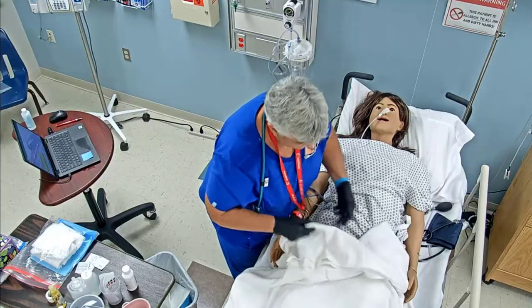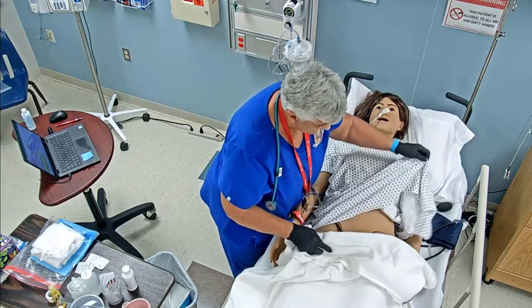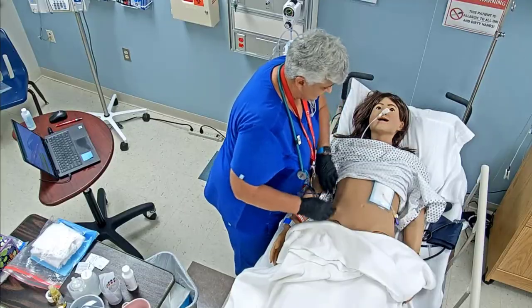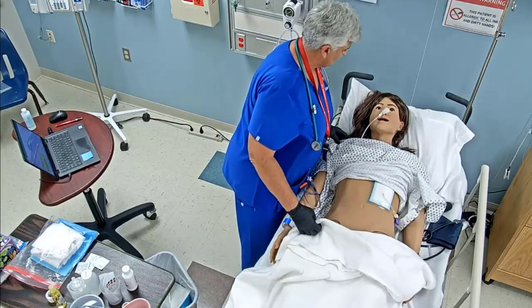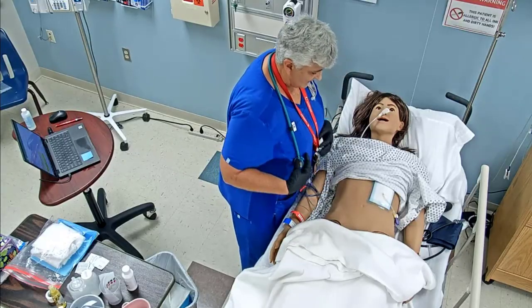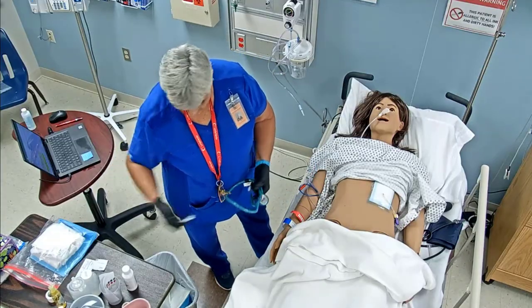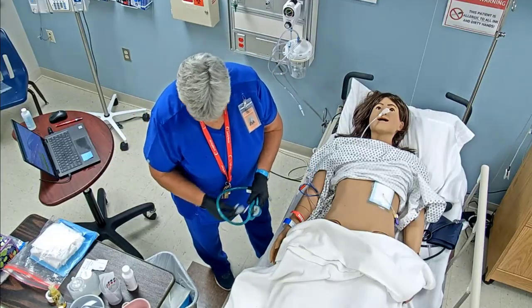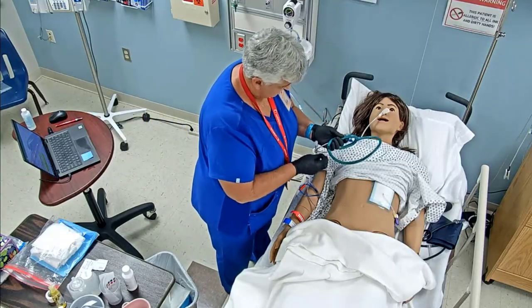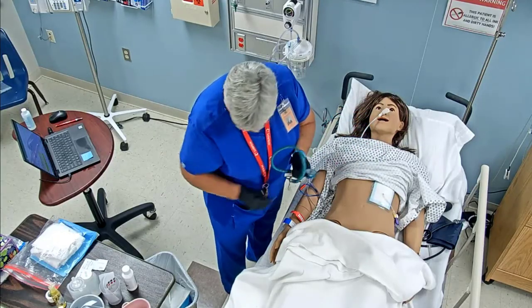Okay, so we've provided privacy. Now, as I said, we're going to be taking that NG tube out. So the doctor has ordered us to do that, and I will tell you and explain to you everything that we're going to do as we do it. Okay, so I'm going to do an inspection. Okay, and we're going to go ahead and auscultate now. And hopefully we hear those bowel sounds being about the same, or being regular now.